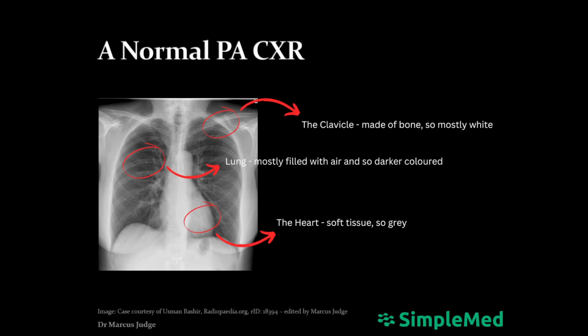Before being able to identify pathology on a chest X-ray, it is important to become comfortable with what a normal chest X-ray looks like, including the anatomical landmarks to look out for. On the screen is a normal posteroanterior chest X-ray. The landmarks highlighted are just to help you orientate yourself on the image. We will talk about a systematic approach to understanding a chest X-ray shortly. They are also a good example of the different types of densities of tissues and how they appear on a chest X-ray.